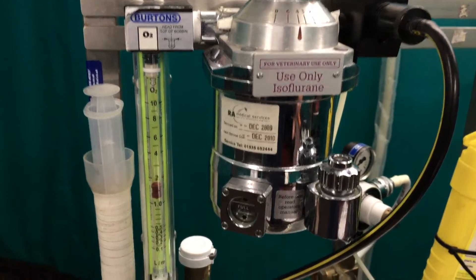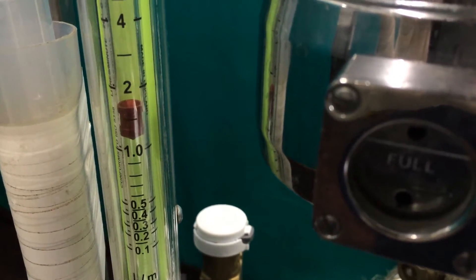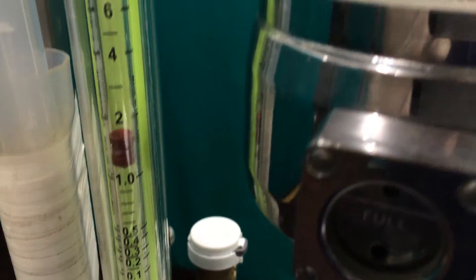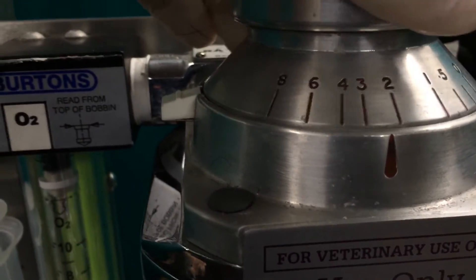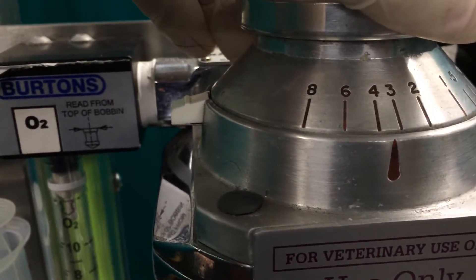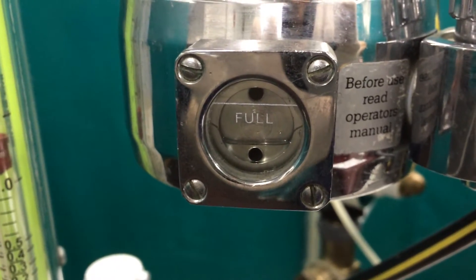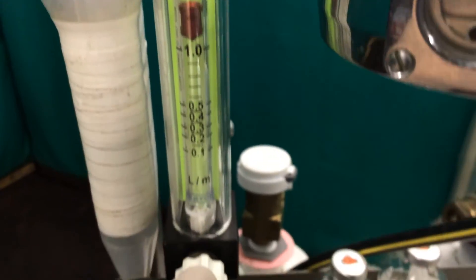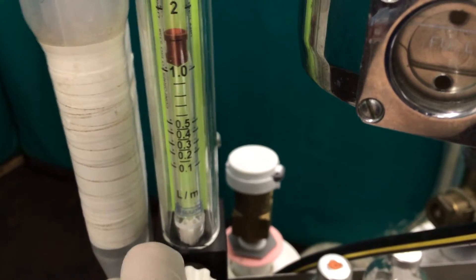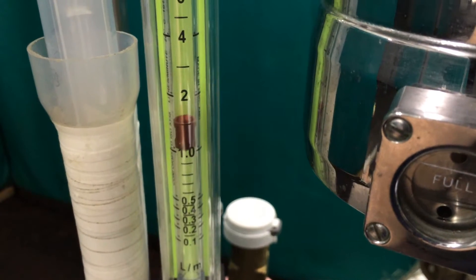We have a dial on the left that shows us that the oxygen is flowing, and at the moment the oxygen is flowing at one and a half litres a minute. And then we have our anaesthetic vaporiser here which we can adjust. I'll just lower the setting to three and a half, check that there's still enough anaesthetic vapour in there, and I may just adjust the oxygen flow rate as well on the dial. So that's the vaporiser and the oxygen.